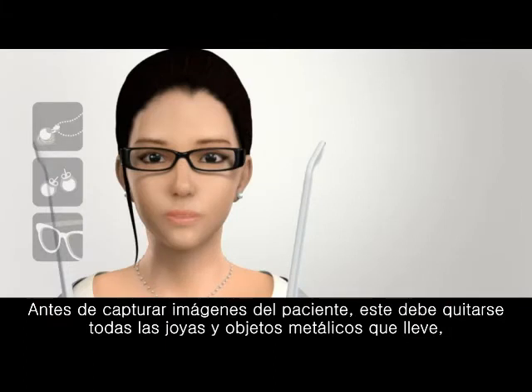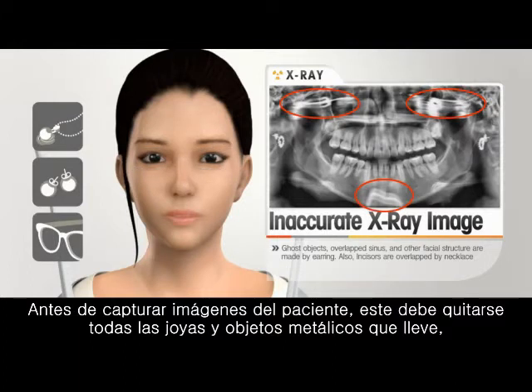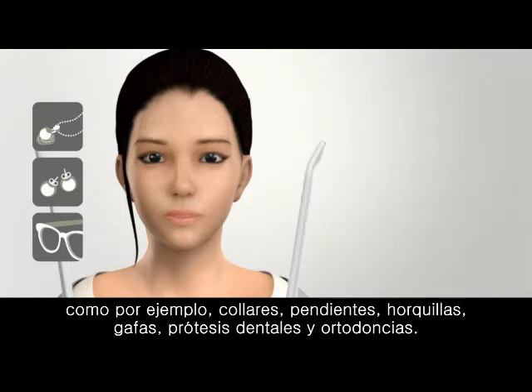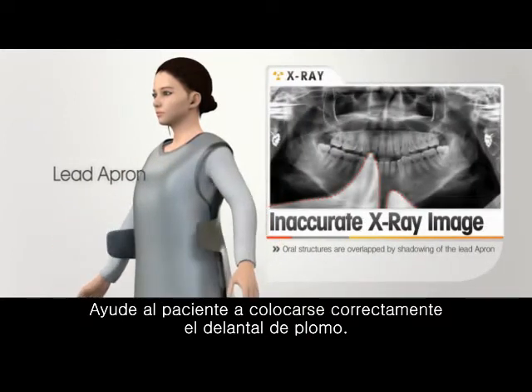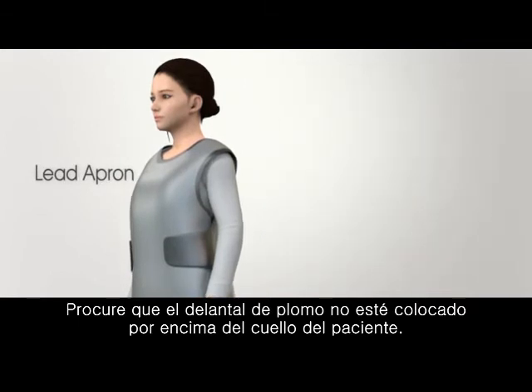All jewelry and metallic objects such as necklaces, earrings, hairpins, eyeglasses, dentures, and orthodontic appliances should be removed before patient image capturing. The patient can keep their removed jewelry personally or place it on the guided shelf. Assist the patient to appropriately wear the lead apron. Be careful the lead apron is not above the patient's neck.